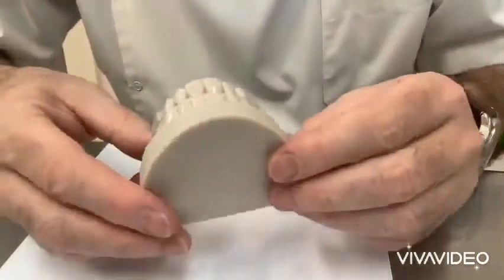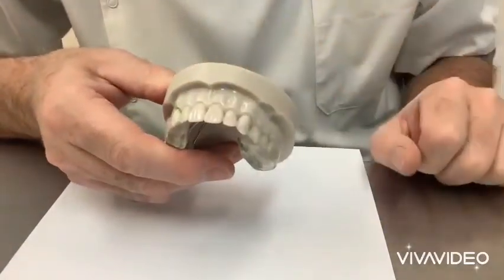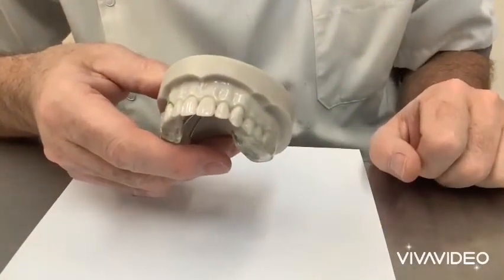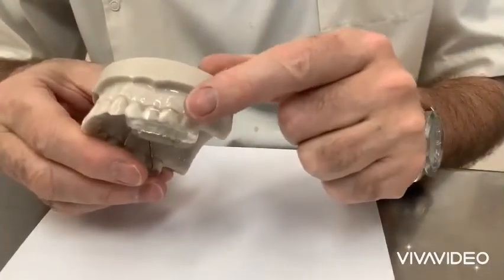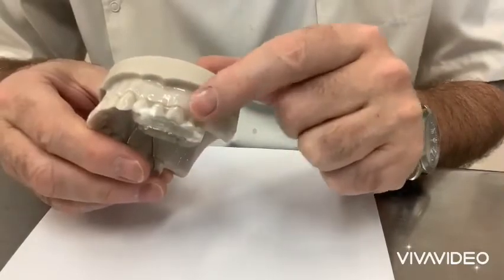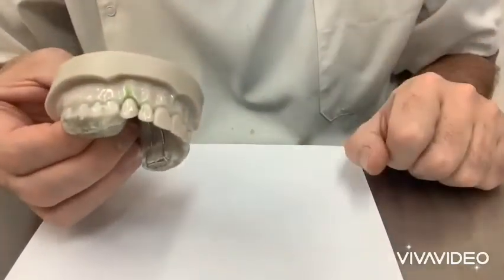What you can do with the upper appliance, you can also put brackets on the front here, so you can be aligning your teeth at the same time that you're getting your class two correction. You could also put buccal tubes in the acrylic back here so that you can put your arch wire into those buccal tubes.